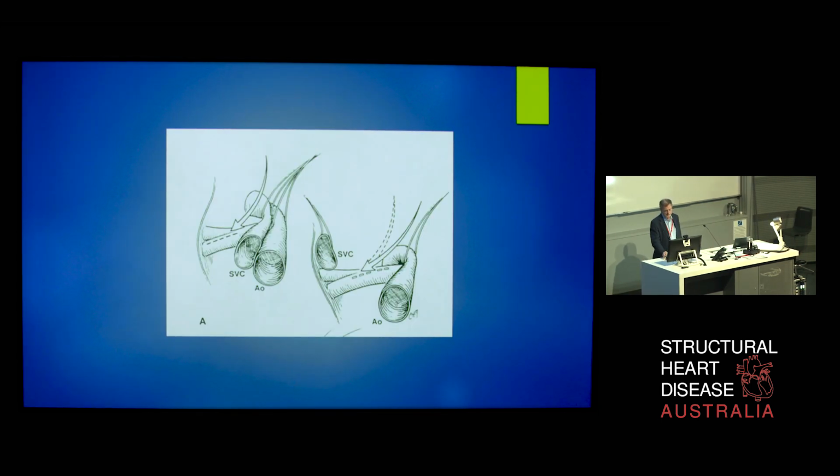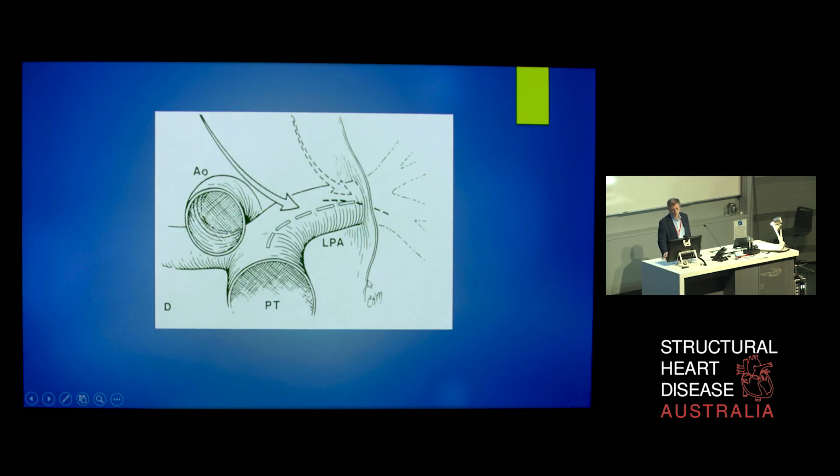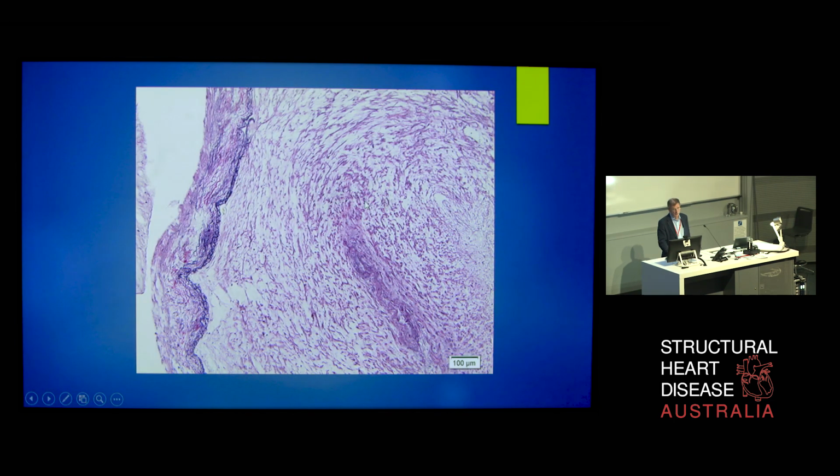So our access to the right pulmonary artery can be either lateral to the superior vena cava, or, the technique I use, between the superior vena cava and the ascending aorta. And on the left side, from an incision made from the main pulmonary artery out onto the left pulmonary artery to the pericardial reflection. And this is the whole key to the operation. You've got to be in the right plane.